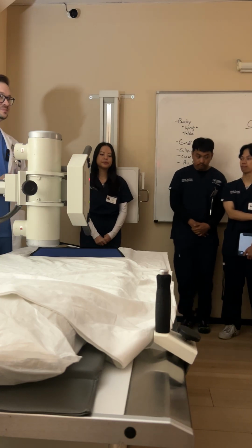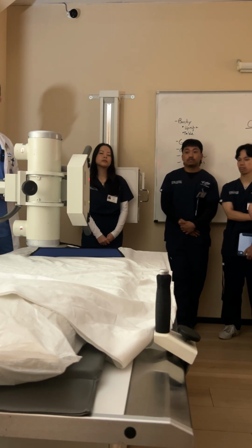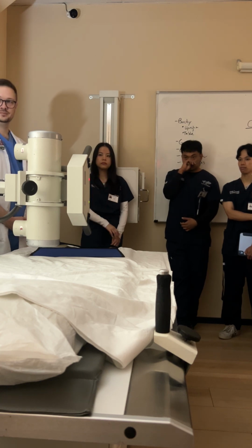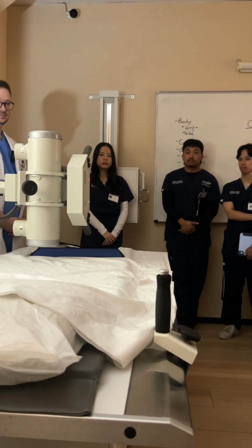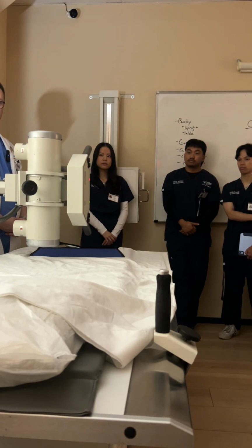Questions? Continuing on that, post-heart surgery, they cannot lift their arms. They're not allowed to. So this is the best that you're going to get. They also have their chest sutured together. The positioning of a lateral can change very quickly if you do the breathing instructions.